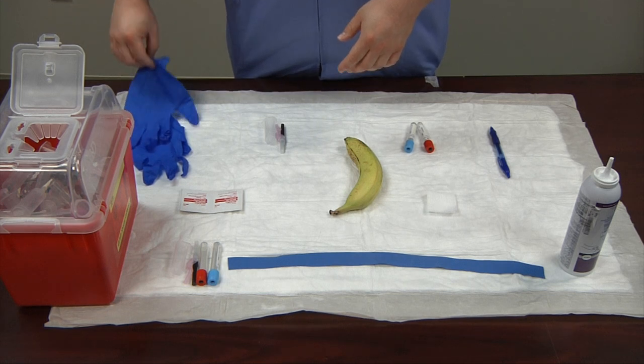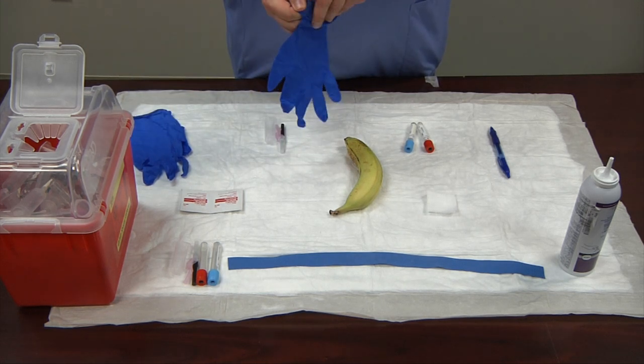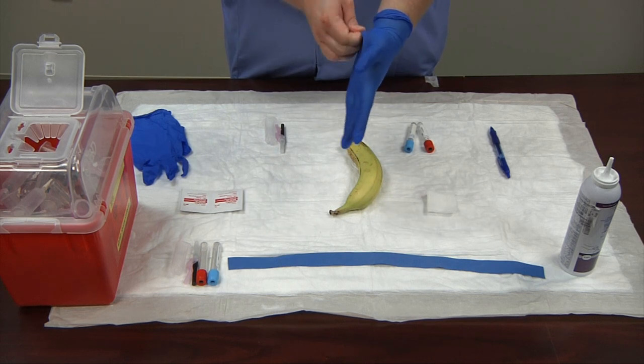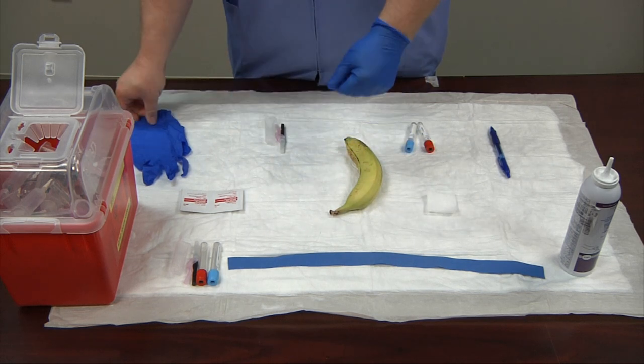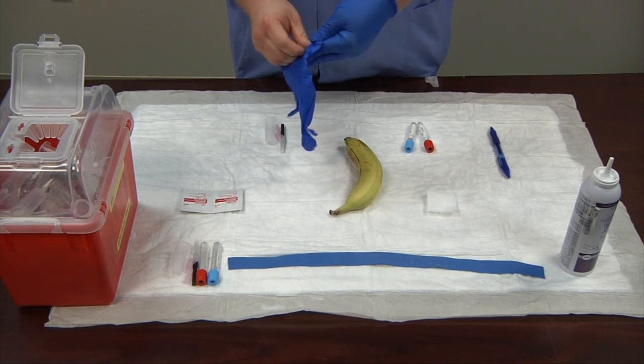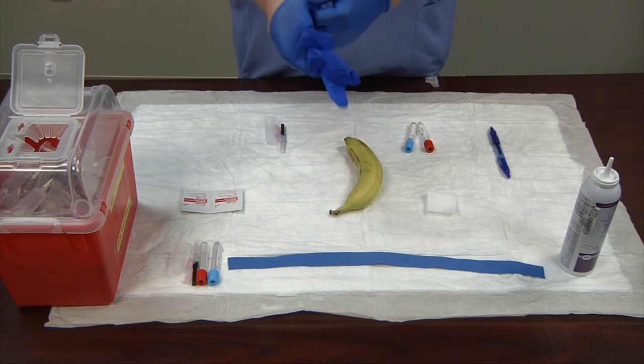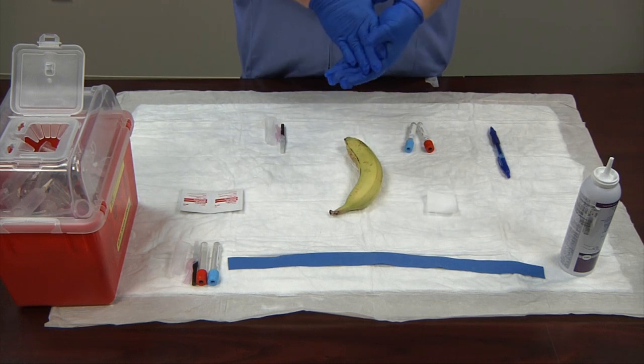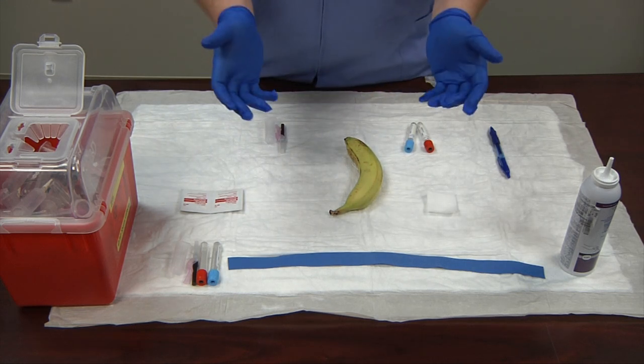Now I'm going to don my gloves. Make sure you have a good, tight, snug fit. As you can see, my fingers are good and snug in the gloves — I don't have too much excess on the fingertips. In phlebotomy, you need a good tight feel against your fingers so you can palpate the vein easily.